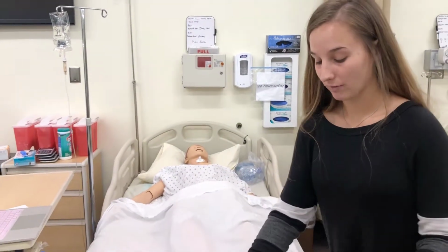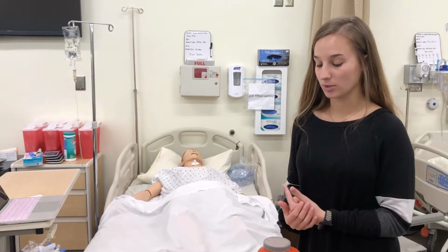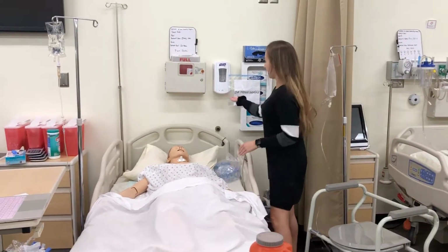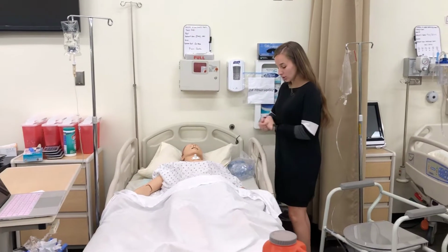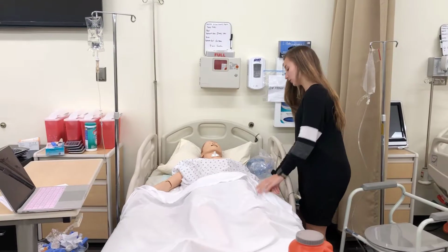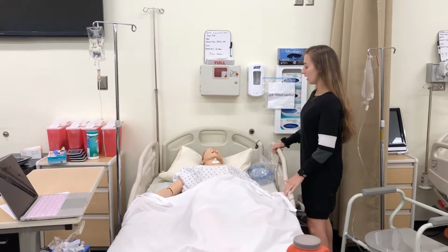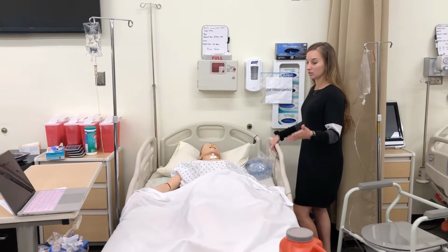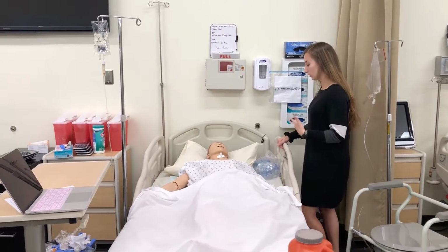So basically, after I have all my supplies, I could go in my patient's room and just explain my procedure. Hi, my name's Naomi. How are you today? Good. Can you give me your name and date of birth? Naomi Rascovi, 6499.